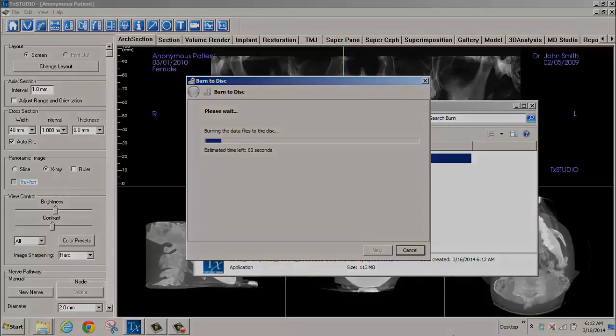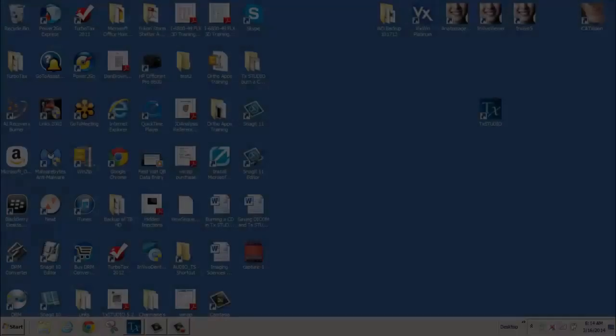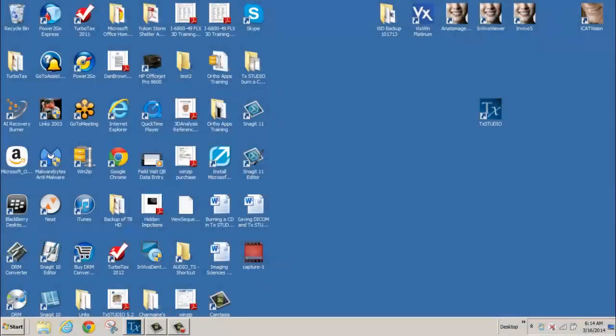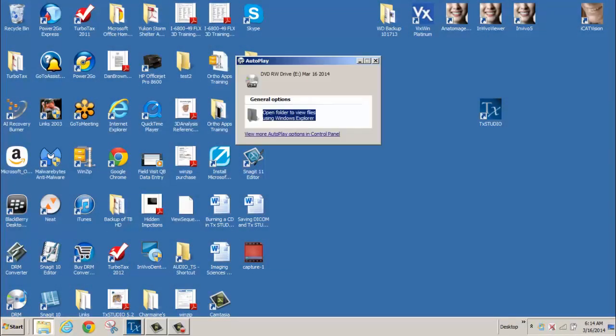When the completed CDR is inserted into a player, the AutoPlay pop-up window will appear. Select Open Folder to view files using Windows Explorer.